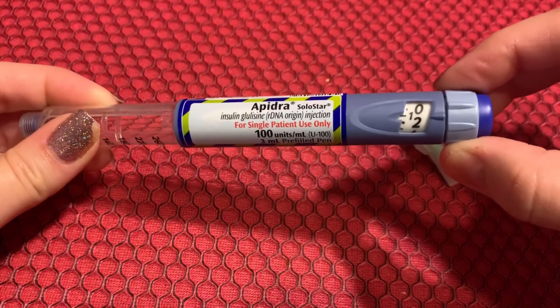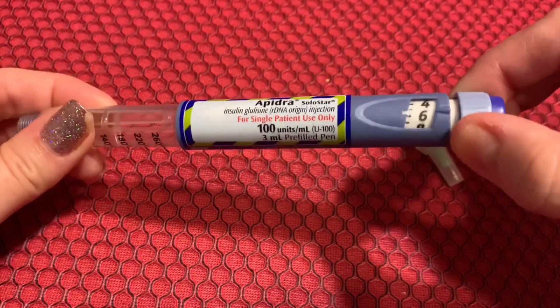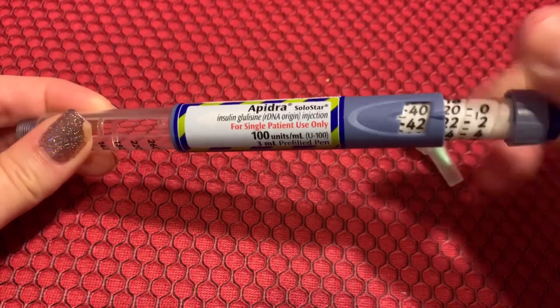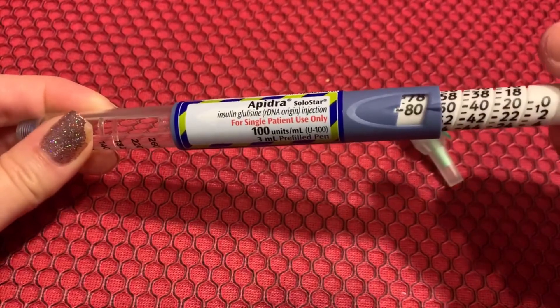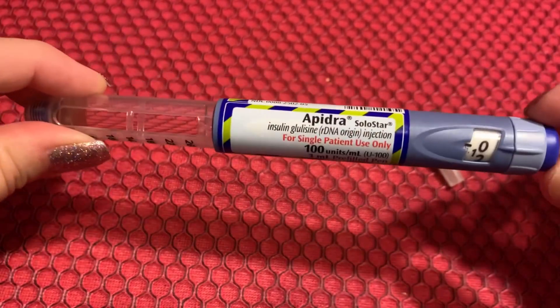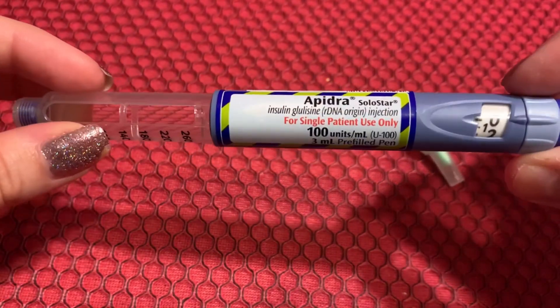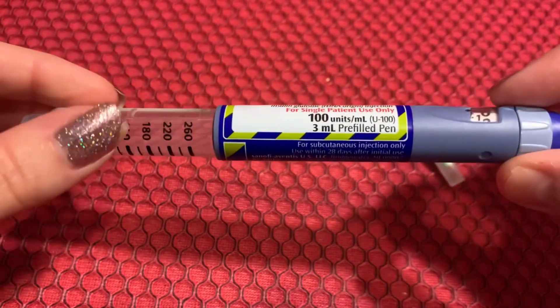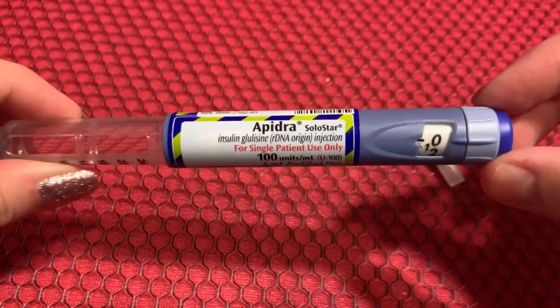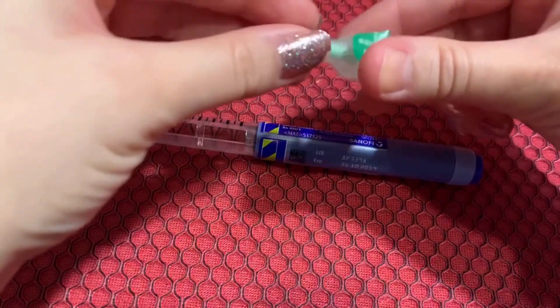The pen makes nice little clicky sounds, so if you have some difficulty seeing, this is really helpful because you can use the clicks to dial up your insulin, and you can go back and forth if you make a mistake. First step is to get your materials together and make sure you have the right insulin. Note that NPH is a cloudy intermediate-acting insulin — that's the only time your insulin should be cloudy. If it's cloudy and you're using Novolog or something like that, throw out the pen. Inspect that you have enough for your dose and that you have the correct insulin.